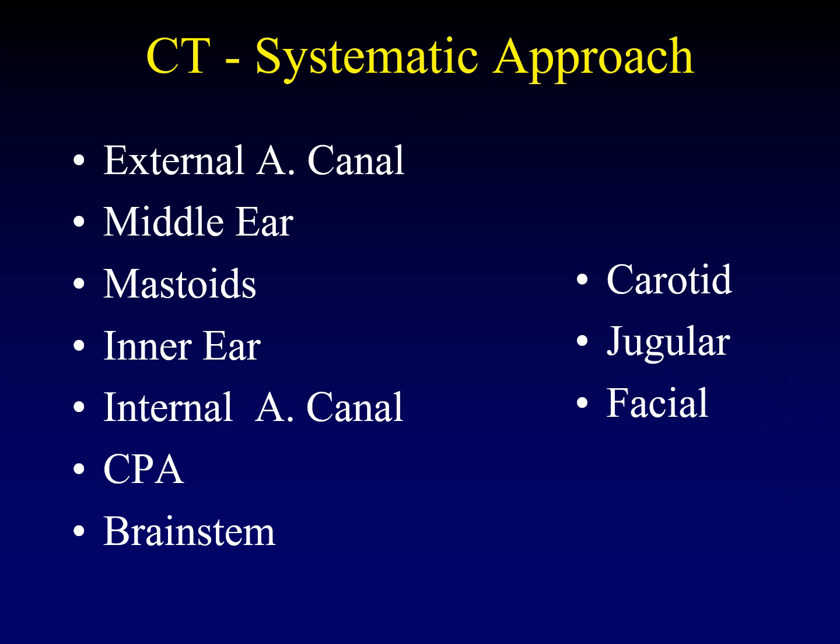When interpreting CT of the temporal bone, it's important to have a systematic approach. I like to work from the outside in: starting with the external auditory canal, moving to the middle ear and mastoid air cells, then the inner ear, continuing medially to the internal auditory canal, the cerebellar-pontine angle, and even evaluating the brain stem — those last two are best done on soft tissue kernels. Then I go back and look at particular structures: the carotid artery, the jugular vein and jugular bulb, and the facial nerve.